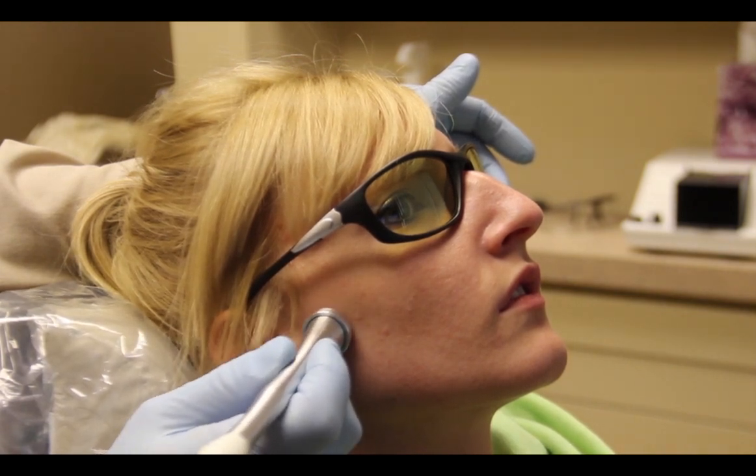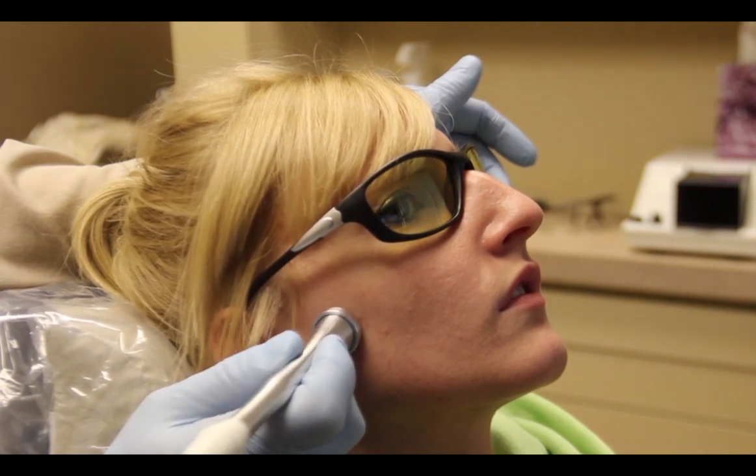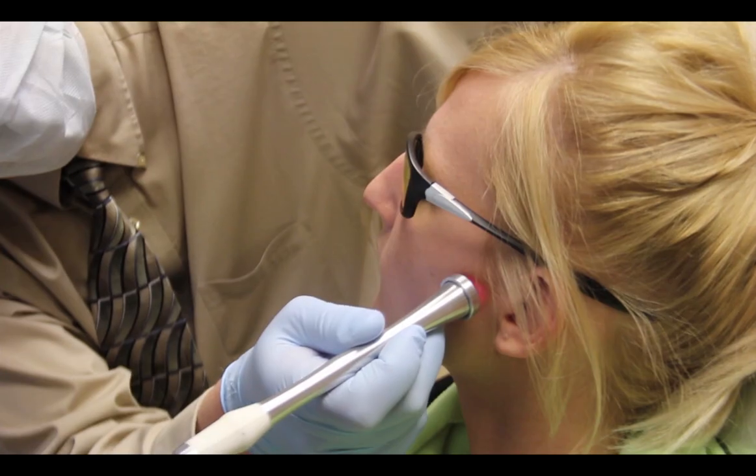Once we finish one side, we'll switch over to the other side. The patient should feel relief as soon as the treatment is completed.